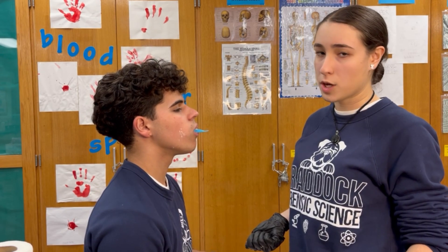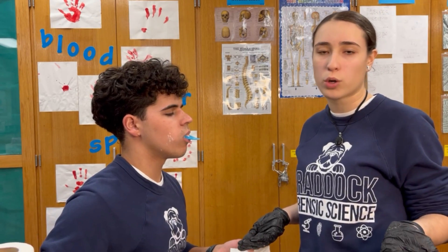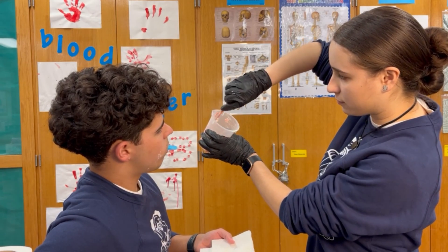After about a minute and 45 seconds, the solution should already be dried up. This can vary depending on the patient's rate of salivation or how much water was added into the mixture. One easy way to check is by grabbing the solution from earlier and seeing if the sides easily peel off — as you can see, they do, which means it is dried up.